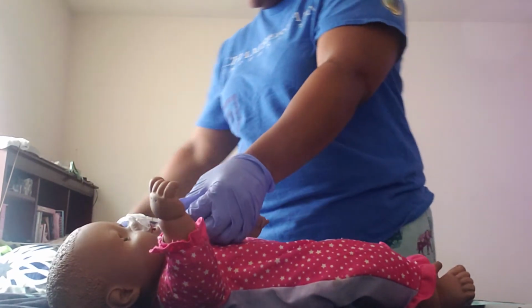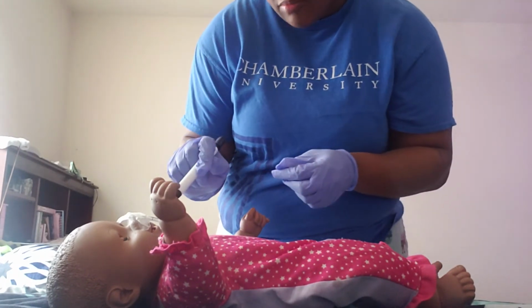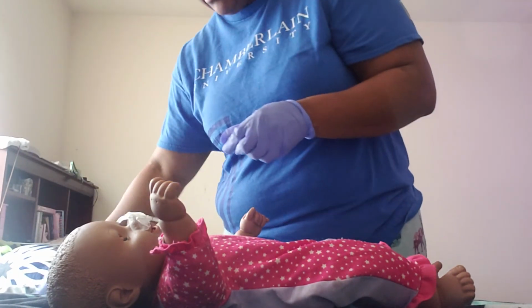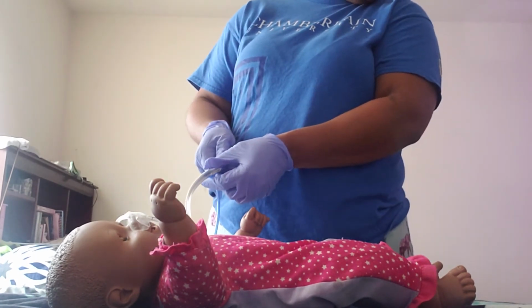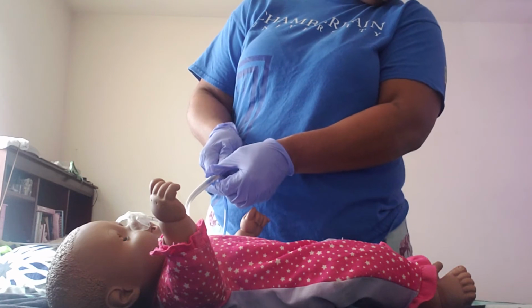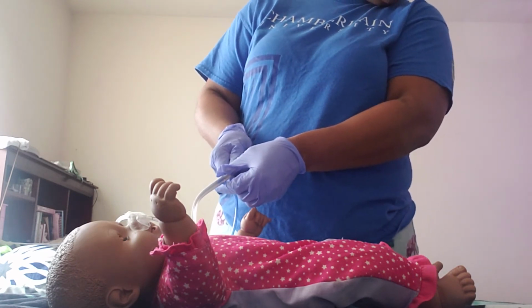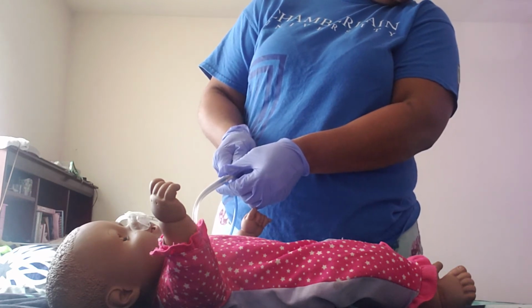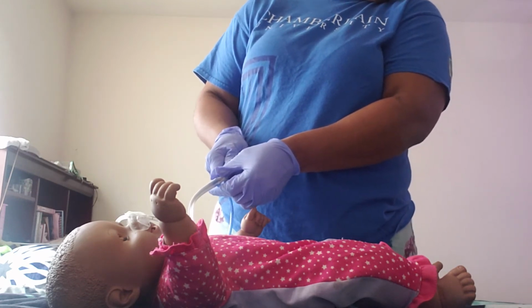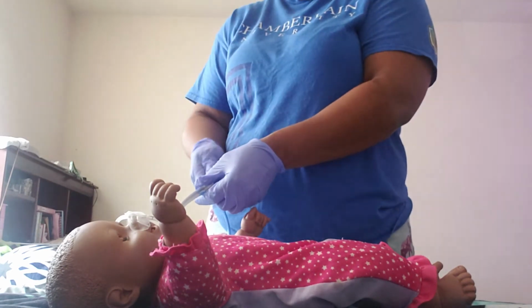And then I'll take my pen light and check the back of the throat and make sure that it's there. And then I will take my 60cc syringe and aspirate some of the gastric contents, hopefully.